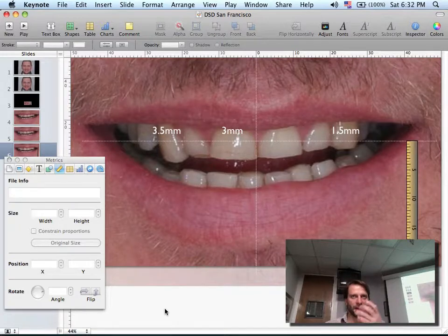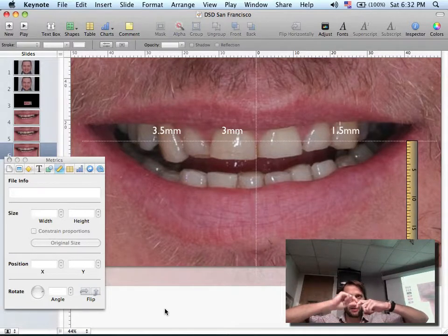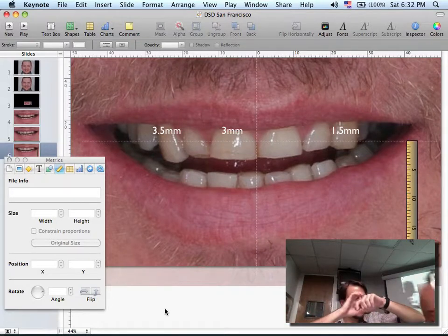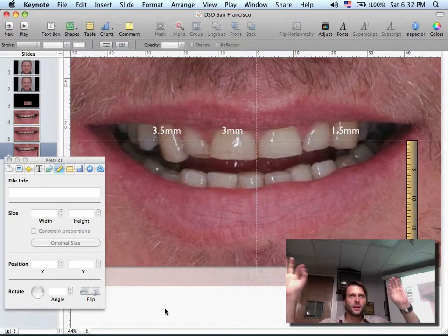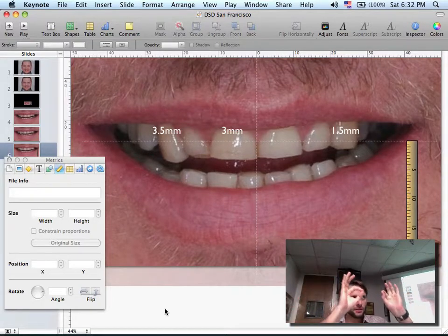He will get his model, he will get his caliper, and he will calibrate the caliper to 1.5 and make a mark on the left cuspid, with a pencil. Then on the right central, calibrate 3 millimeters, mark on the model 3 millimeters. Calibrate 3.5, go to the right cuspid, mark. So you have 3 marks, and then he will just connect these dots. And in this case, the midline is matching, so he will draw the midline, and he has the cross on the model to do the wax up.